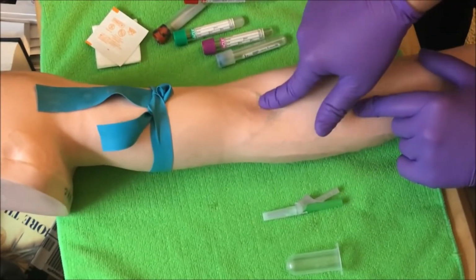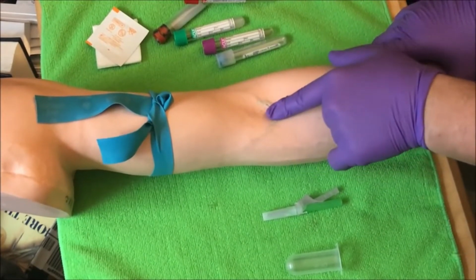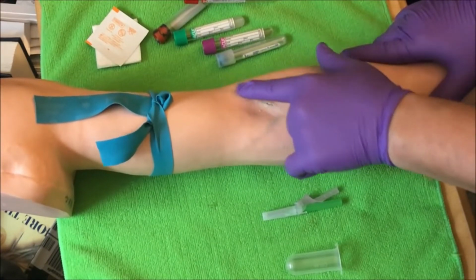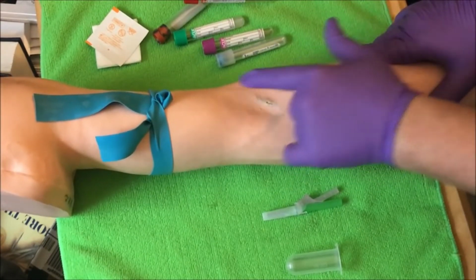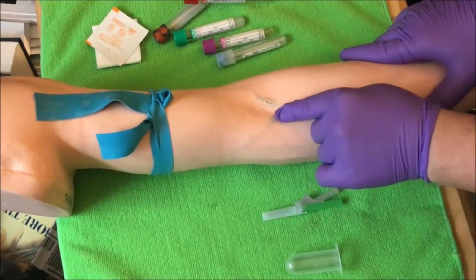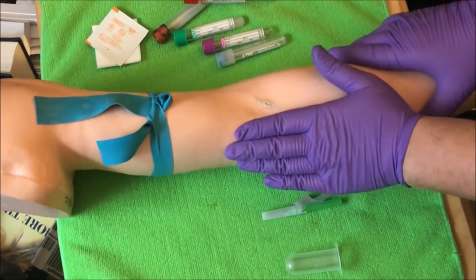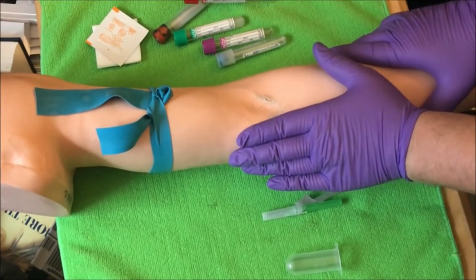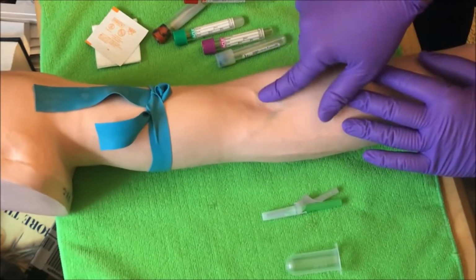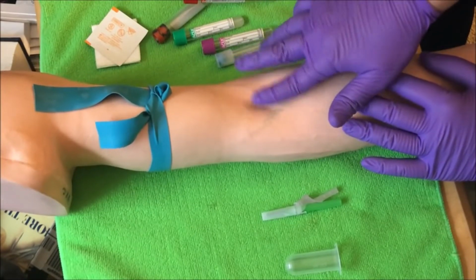So I found a vein I'm good for, whether it's the median cubital, which is dead center. And again, look at my order of veins video. The cephalic could run as median cephalic, or the cephalic runs straight. Or of course the basilic. The basilic can be median basilic, or it can be basilic running straight down. This one I do want to avoid at all costs because of the brachial artery. And again, my order of veins video does explain this in detail. So I find my vein, either median cubital or median cephalic. Then I'm ready to go.